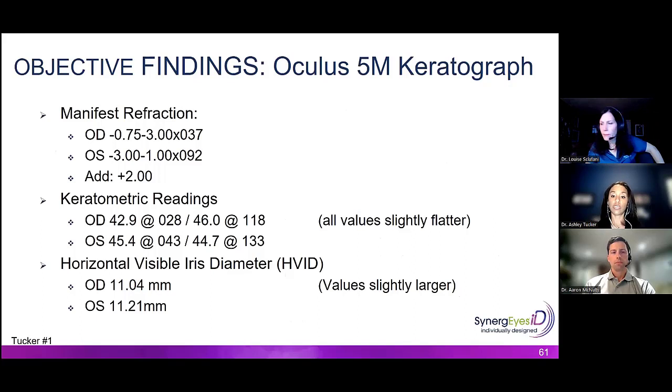So again, a reminder of manifest refraction and K readings. I also was playing around during the early access program and measured HVID in two different ways. One manually with my slit lamp reticle, and the other one was with my topographer using the HVID measurement there.